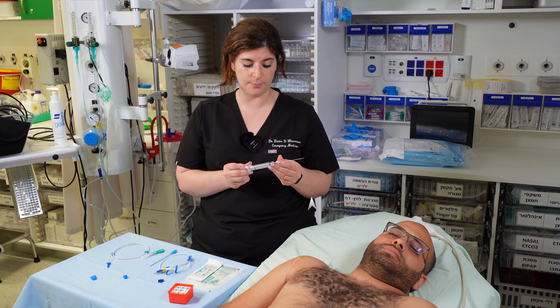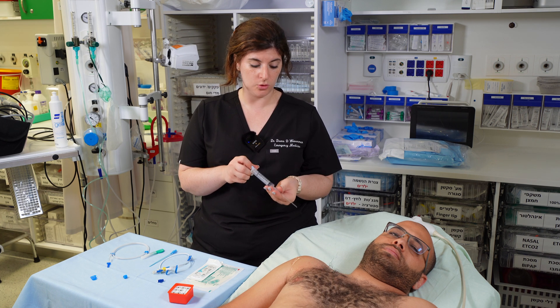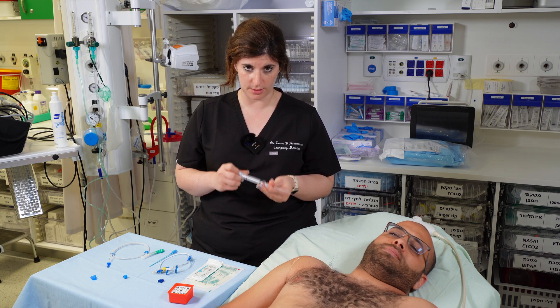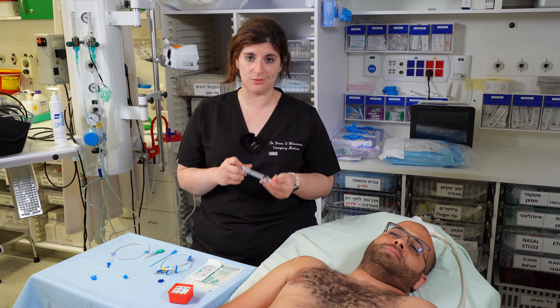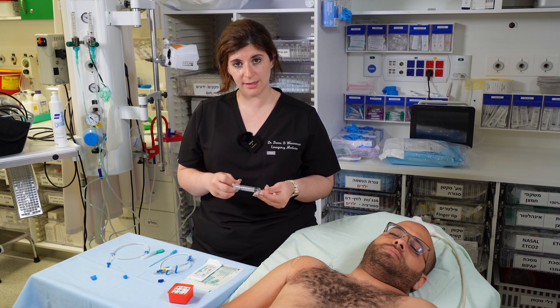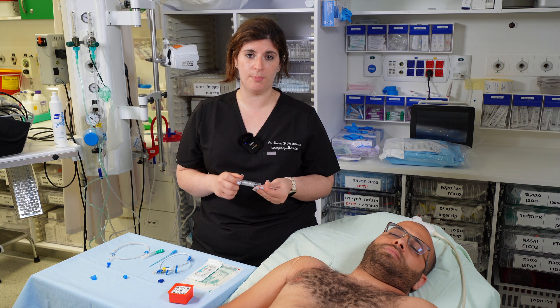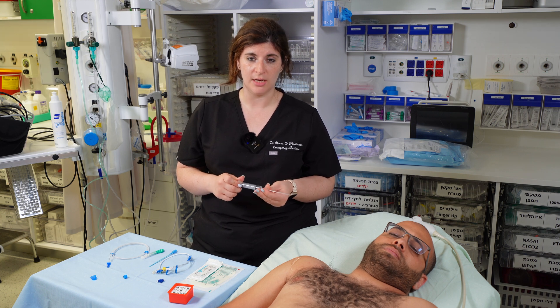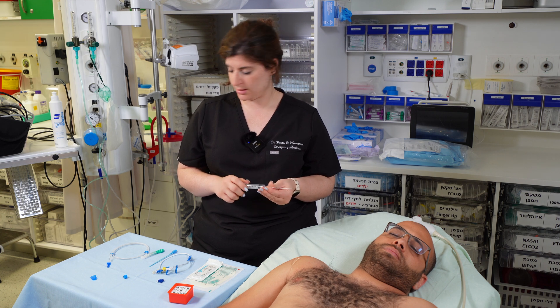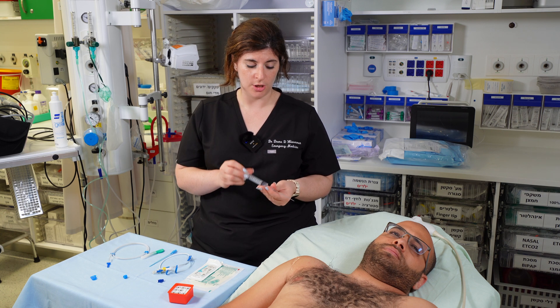As with all ultrasound-guided procedures, always keep an eye on your needle tip. As long as you can see your needle tip, you're not going to cause a pneumothorax and you're not going to go into the artery. If you can't see your needle tip, back up and find it again. The most common pitfall of these procedures is losing the tip of the needle and not knowing where you're going with it.